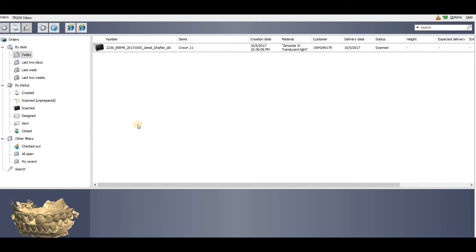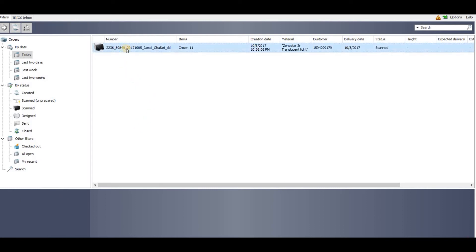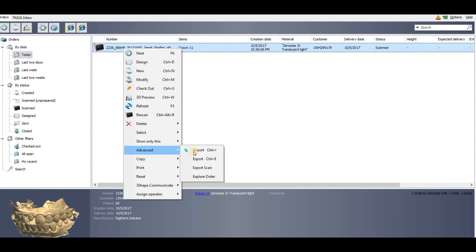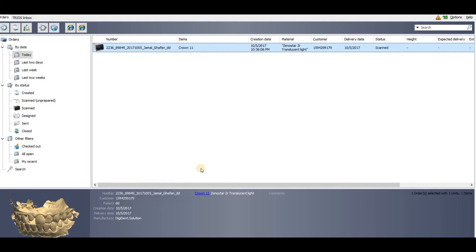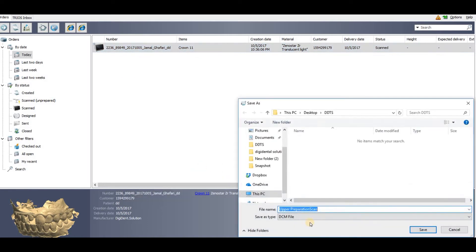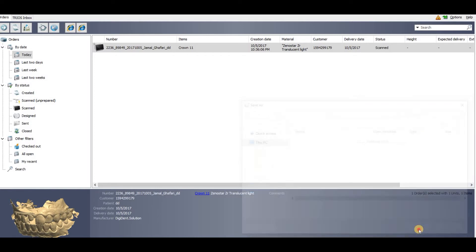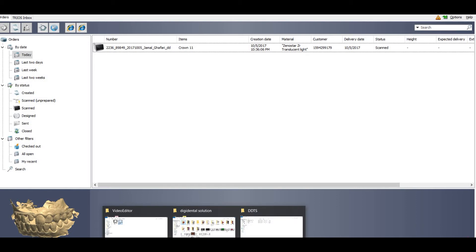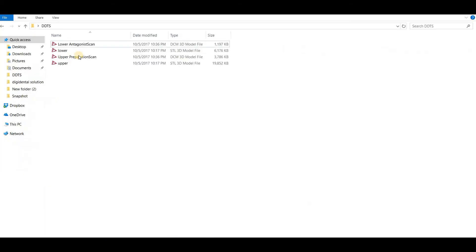That's all. There are two or three different ways to get the output DCM files. The easiest way is to just right-click, and in the advanced menu you can export scan. It will give you the option for DCM and you can save it in the folder. You can check now - you have two STL and two DCM of the same model.